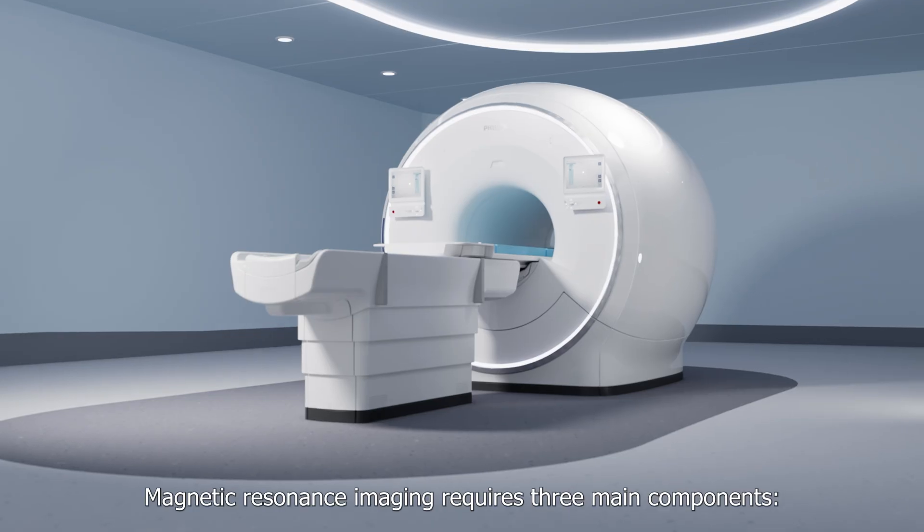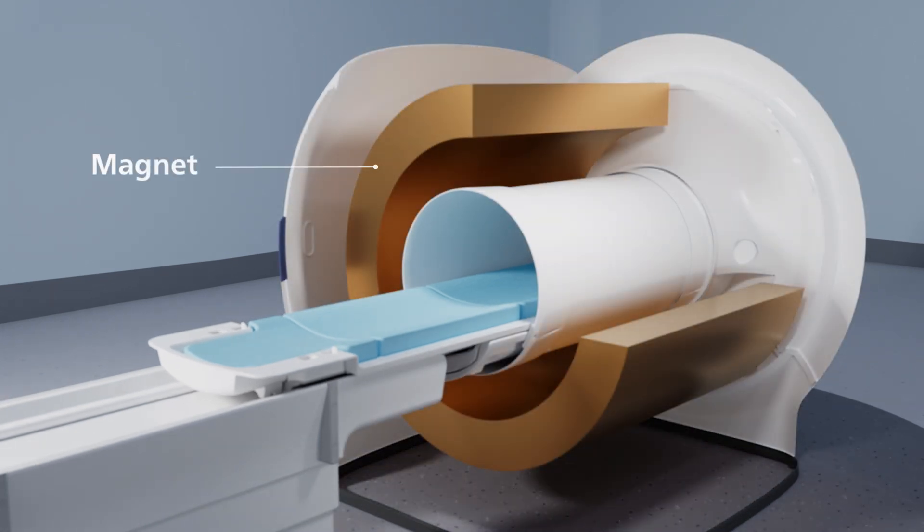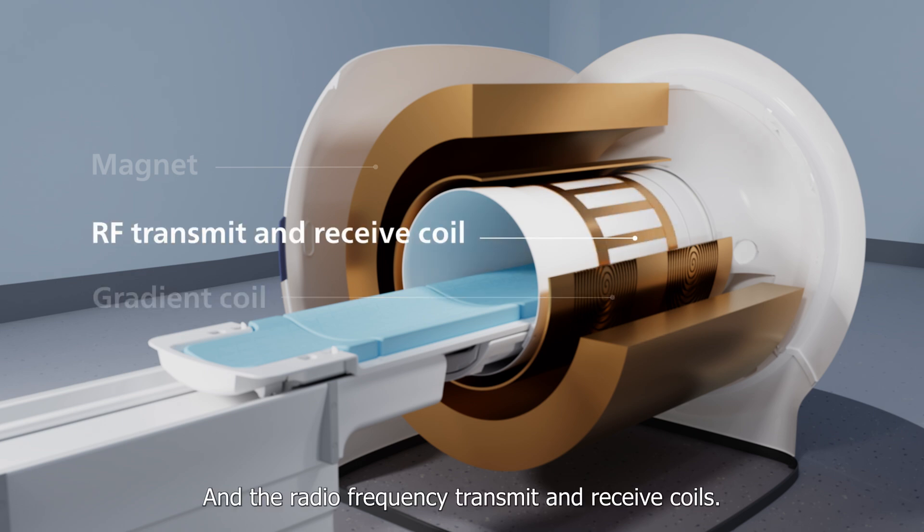Magnetic resonance imaging requires three main components: the magnet, the gradient coils, and the radio frequency transmit and receive coils.